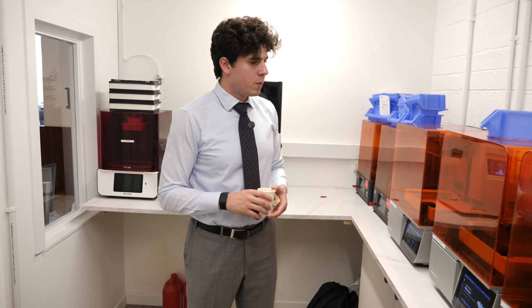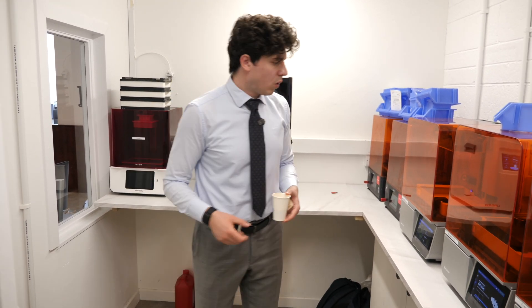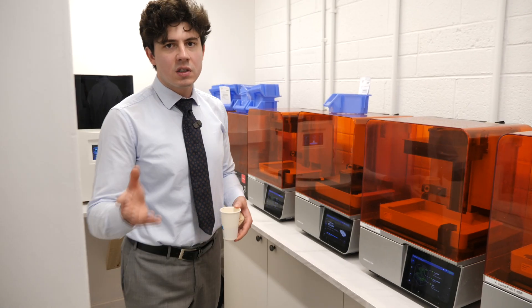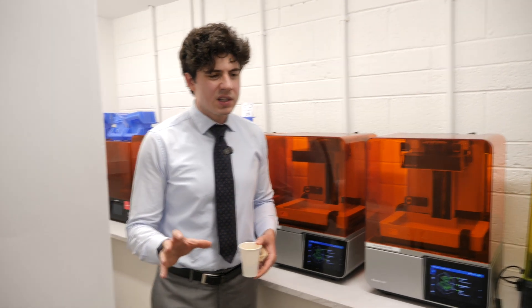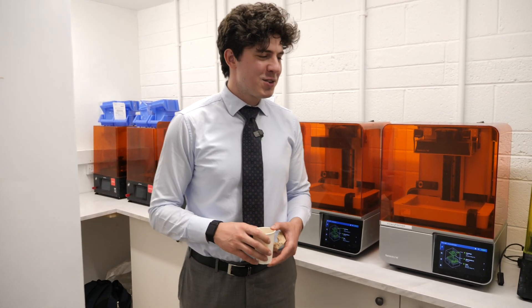We're in our 3D printing room and we want to talk about the decision-making around why we selected these machines — their advantages and disadvantages, what they can and can't do, their costings. This will be a full review, for patients and dentists alike, mostly for dentists as it may be too technical for patients, but we hope that everyone will watch it.